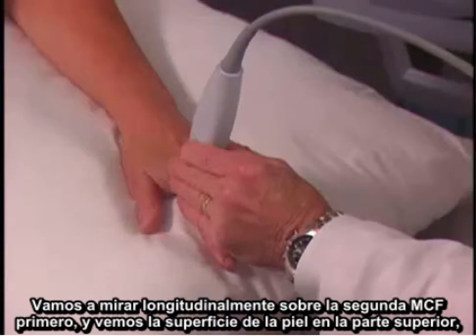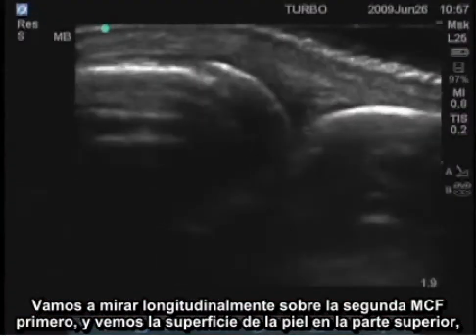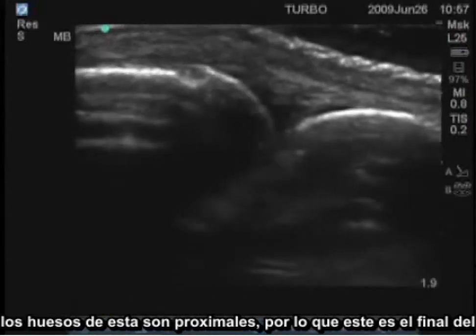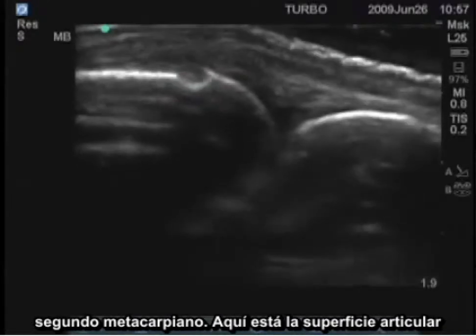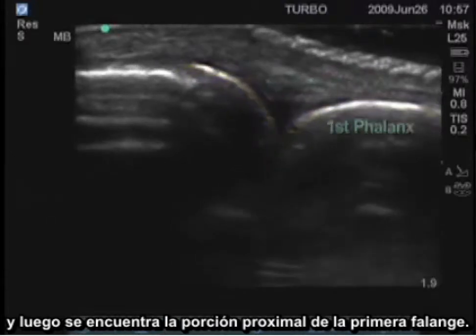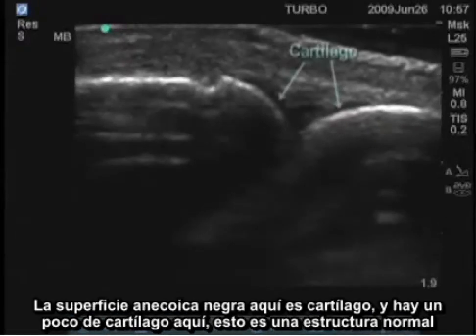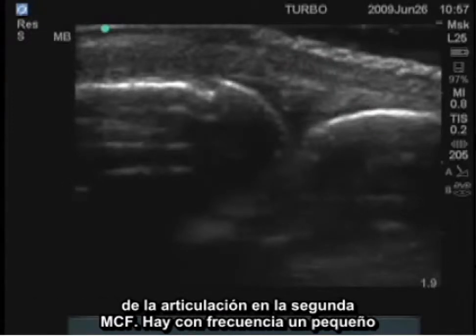We'll look longitudinally over the second MCP first and see the skin surface on the top, the bones — this is proximal, so this is the end of the second metacarpal. Here's the articular surface, and then here is the proximal portion of the first phalanx. The black anechoic surface here is cartilage, and there's some cartilage here — this is a normal joint structure at the second MCP.